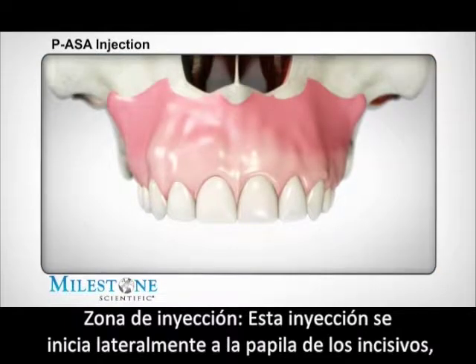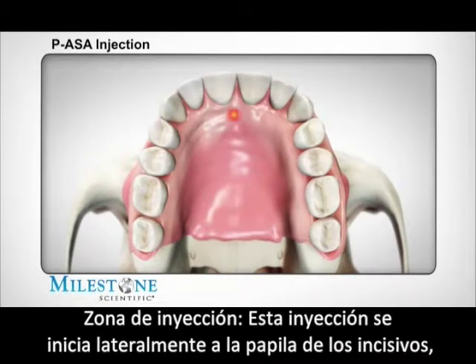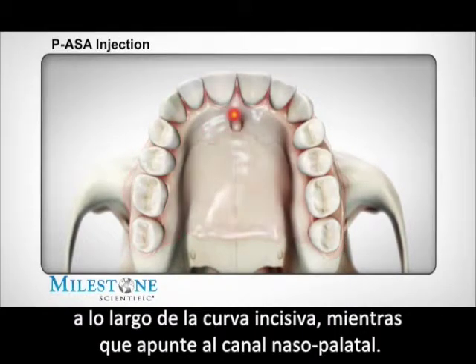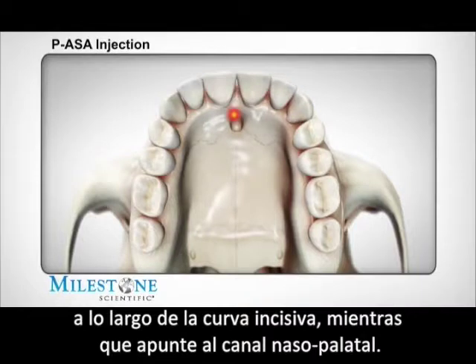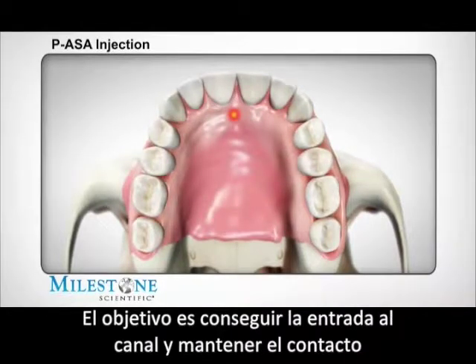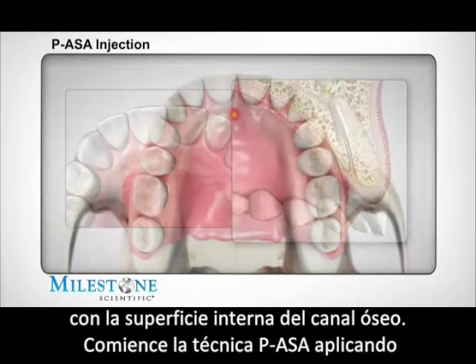Site of injection: This injection is initiated just lateral to the incisive papilla along the incisive groove while targeting the underlying nasopalatine canal. The objective is to gain entrance into the canal and maintain contact with the inner surface of the bony wall of the incisive canal.